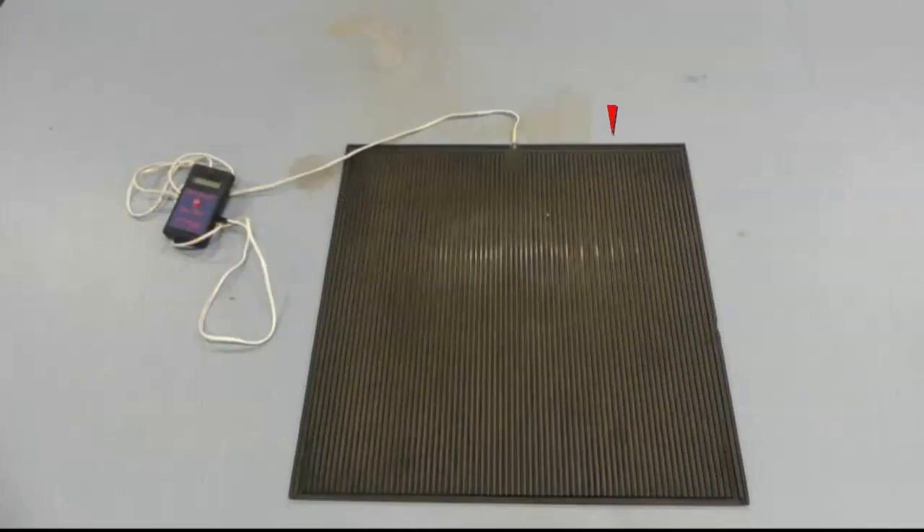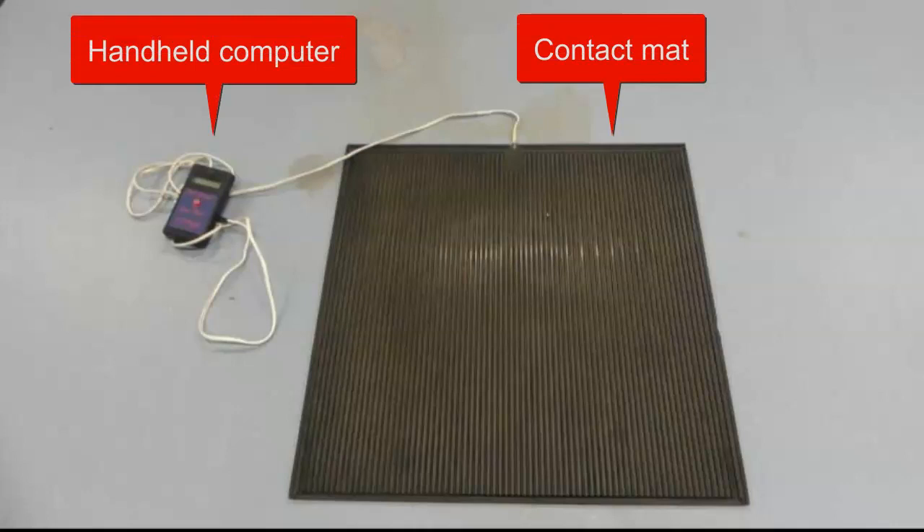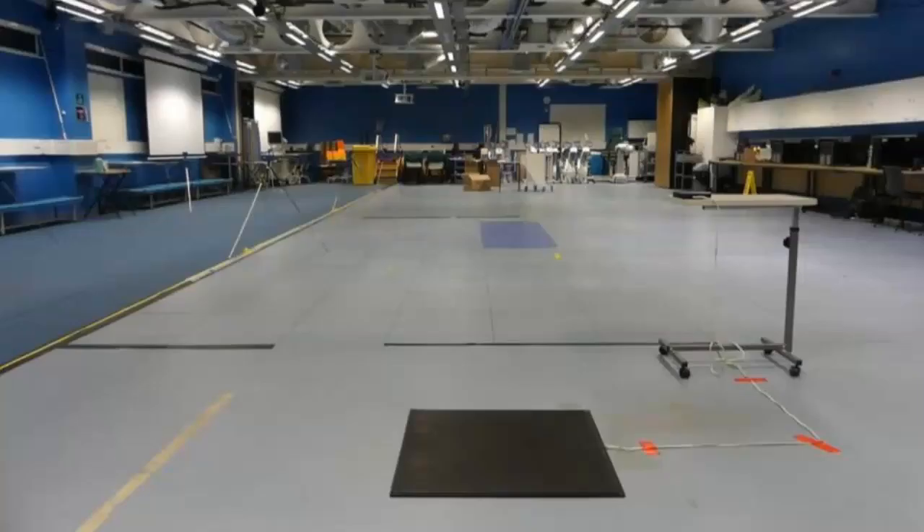The system is made up of the contact mat and also the handheld computer, which will display both flight time and jump height. In order to set up, you simply place the jump mat on a flat surface and take down any of the trailing wires, then you are ready to go.